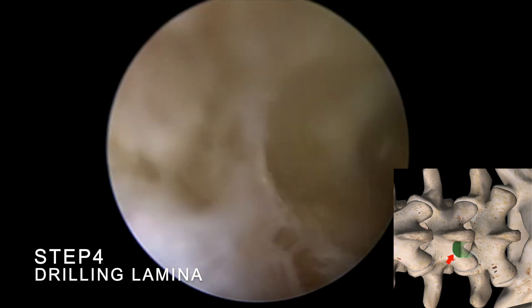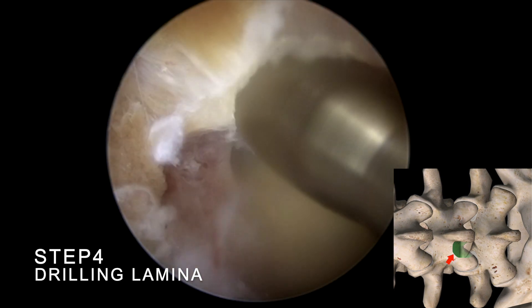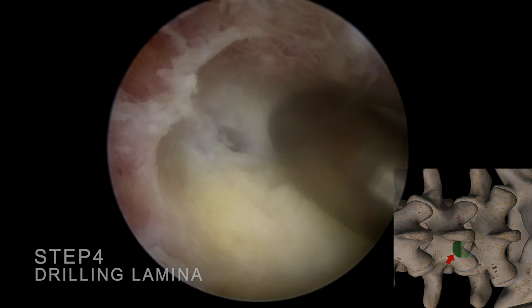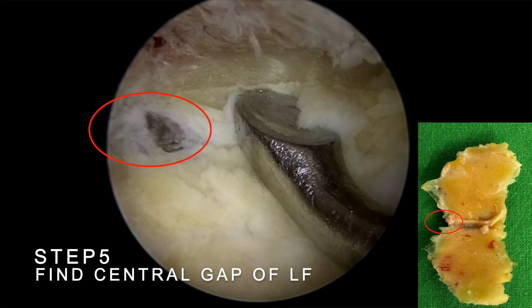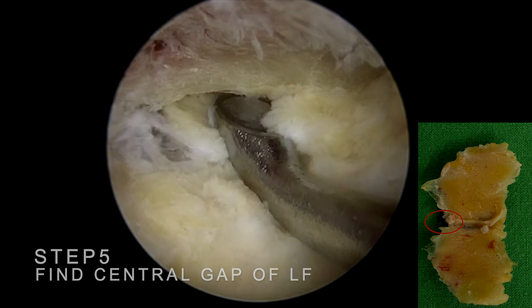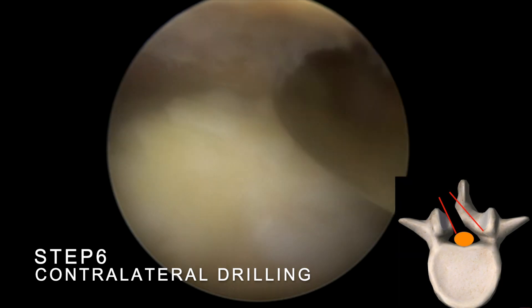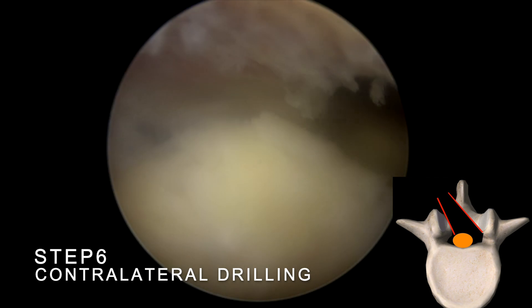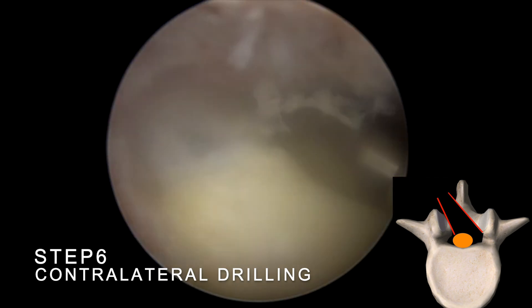Step 4: Once reaching the deeper cortical bone, switch to a smaller high-speed drill and grind along the junction of the ligamentum flavum and bone towards the cranial end. Next, locate the central gap of the ligamentum flavum. Identifying this anatomical structure allows us to confirm the midline. After confirming the midline, proceed with decompression on the contralateral side. Use a high-speed burr to perform sublaminar drilling above the ligamentum flavum.